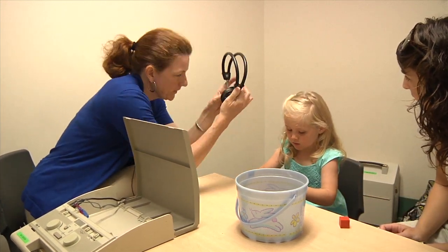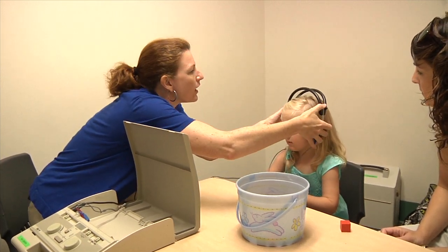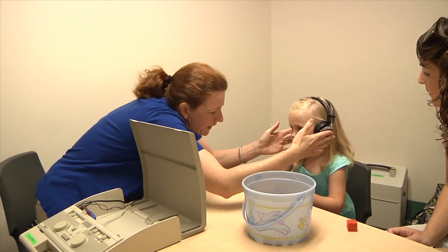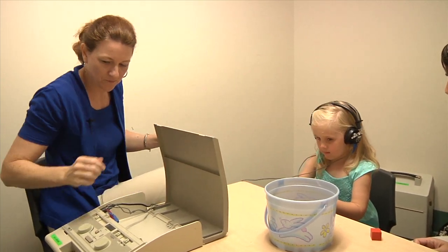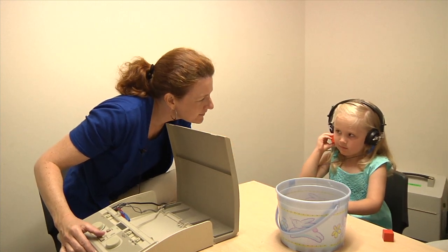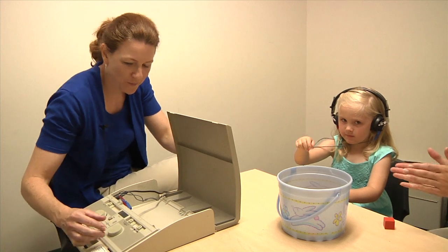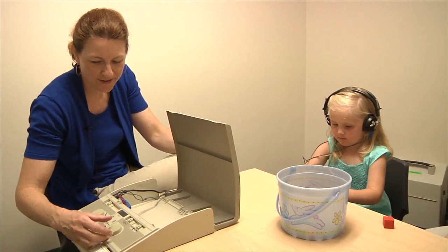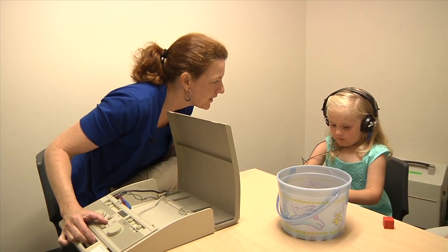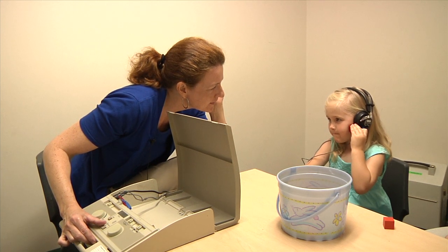Ready? Okay. Look at me. Can you look at me? Here we go. Now, pick a block. Oh, let's hold it by your ears. You ready? Listen, listen, listen. Oh, nice job. Okay, next one. Pick up a block. Oh, by your ear. By your ear. Listen, listen, listen.